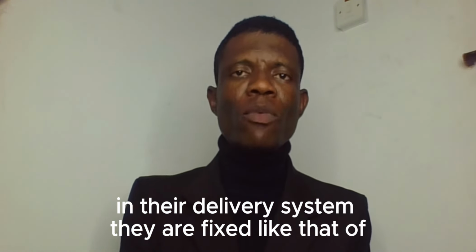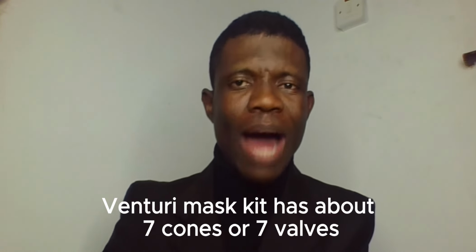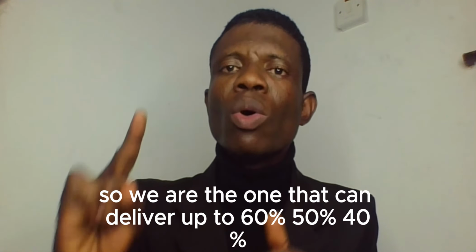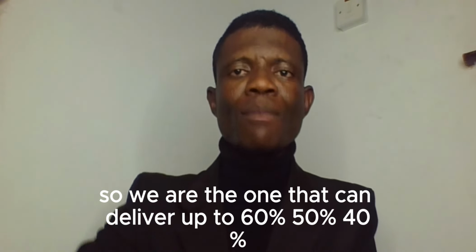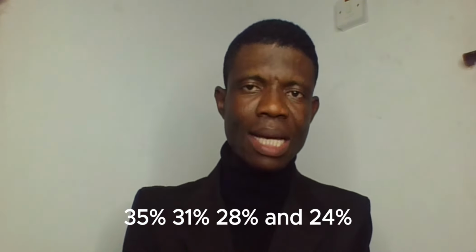Like the Venturi mask kit. The Venturi mask kit has about 7 cones or 7 valves. All these valves are calibrated. So we have the ones that can deliver up to 60%, 50%, 40%, 35%, 31%, 28%, and 24%.